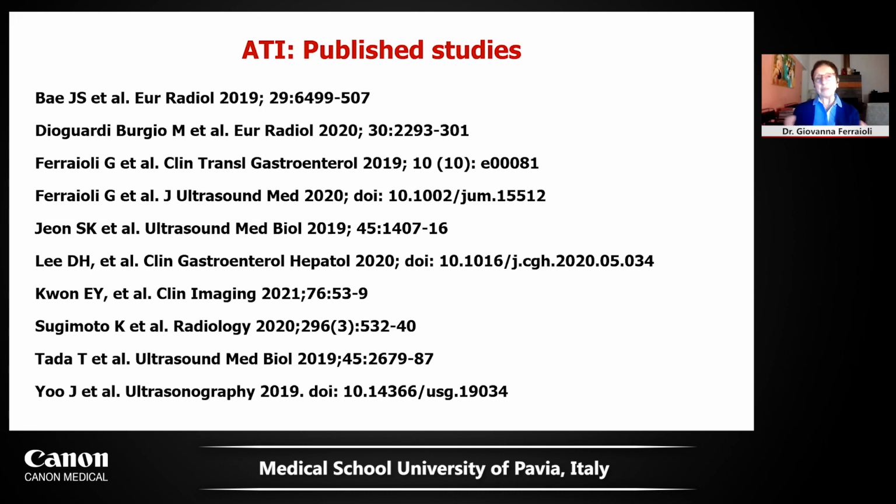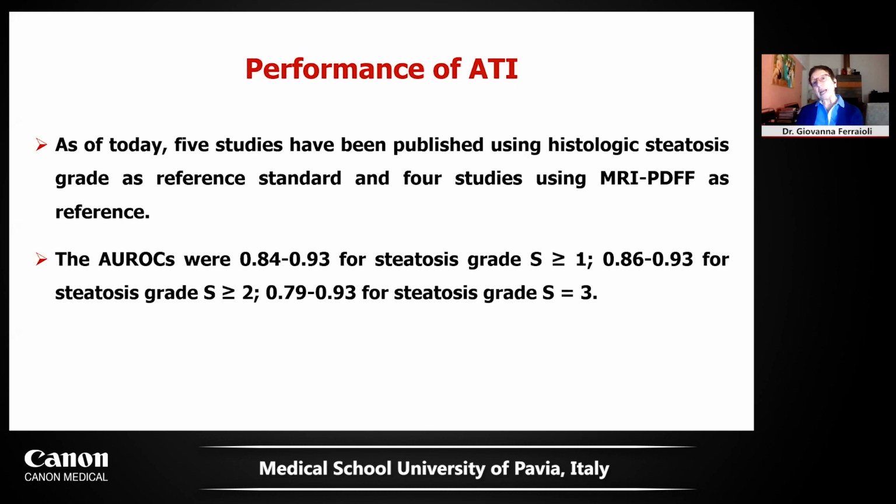ATI is available since very little time, but there are already several published studies in the literature that have looked at the performance of the ATI. As of today, we have 5 studies that have used histology as the reference standard, and 4 studies that have used the PDFF as the reference standard. And in all these studies, the accuracy in detecting and grading liver steatosis was pretty high.